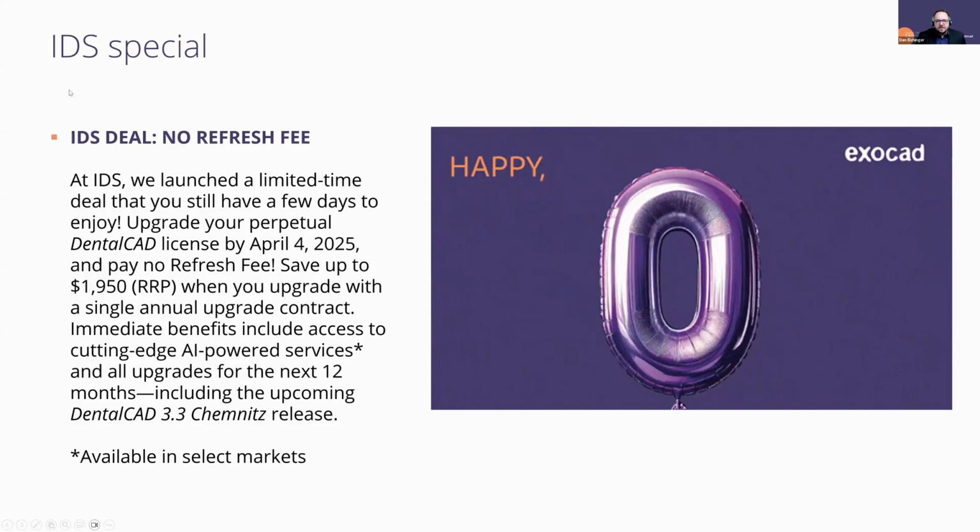So one thing to be mindful of, there are two license models with our software. There's perpetual and flex. When you buy a perpetual license, you own that version for life. Then you have the option to include your update agreement, the update contract. If you choose to opt out of that, then at that point, you can only utilize the latest version you had installed at that time.